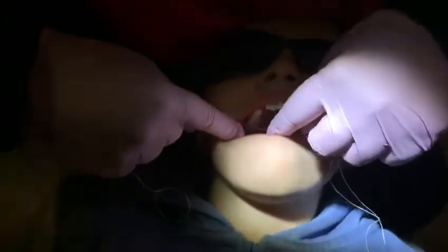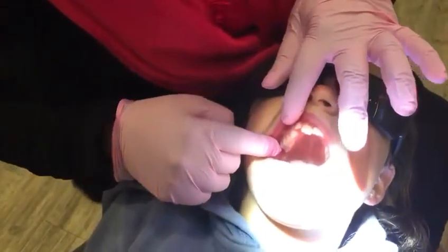It's just a gentle guiding motion, bucco-lingually. You need to make sure that it goes down into the contact point and there's a little click. Then you remove the floss threads.